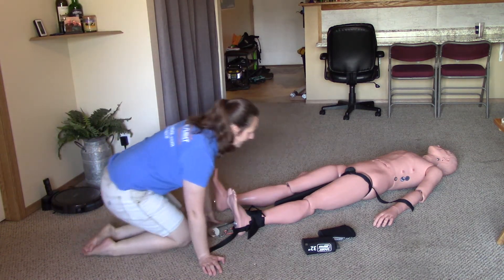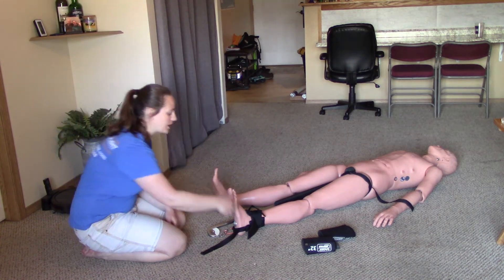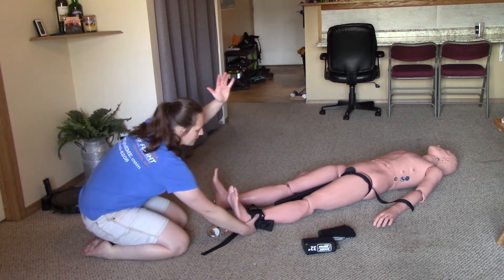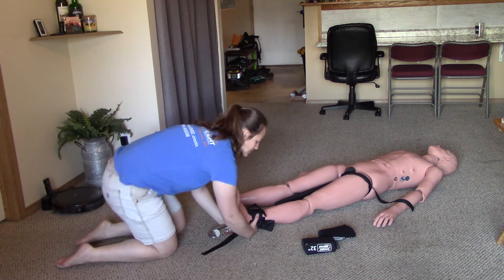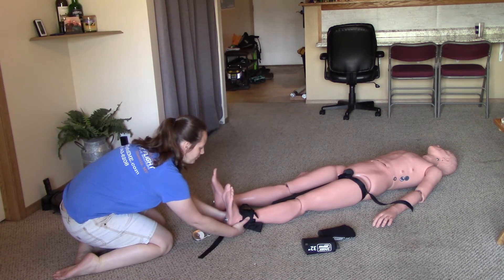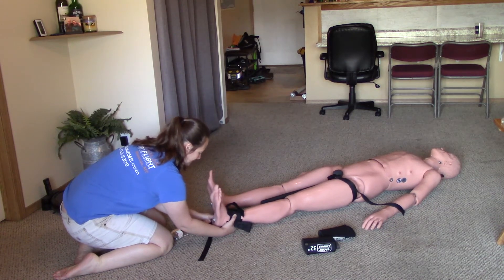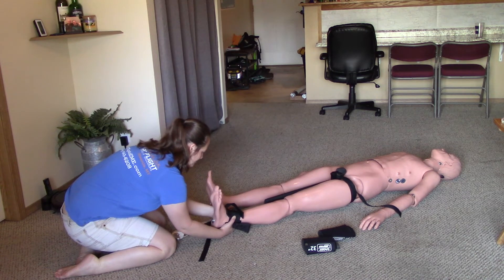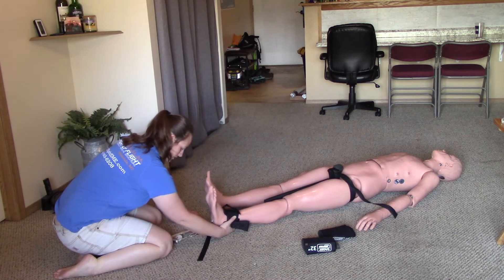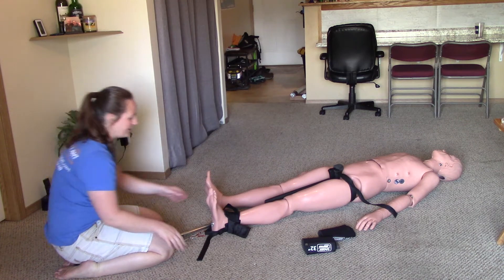I'm now going to apply manual and mechanical traction at the same time. I'm applying manual traction with my right arm — no one has pulled traction on this patient's leg yet — and I'm going to pull mechanical traction with my left arm on the splint. I'll grab the end of the splint and grab the ankle. I don't have a partner holding the patient here, so I probably won't pull full traction, but I'll pull as hard as I can. Get it as tight as you can, go one more click to hold it in place, then you can let go. I'm holding about 13 pounds of traction.